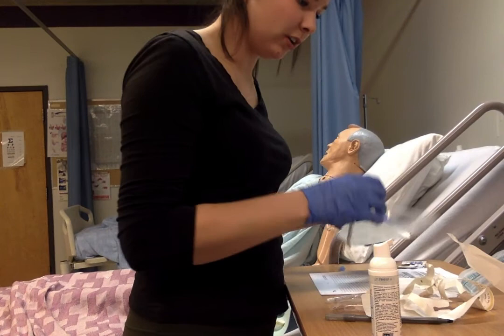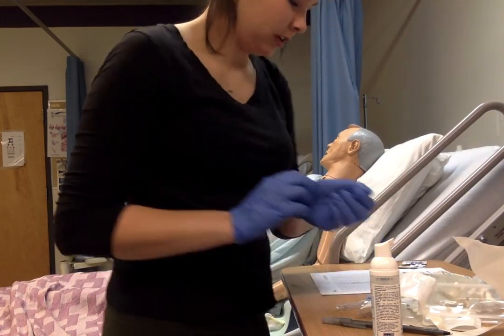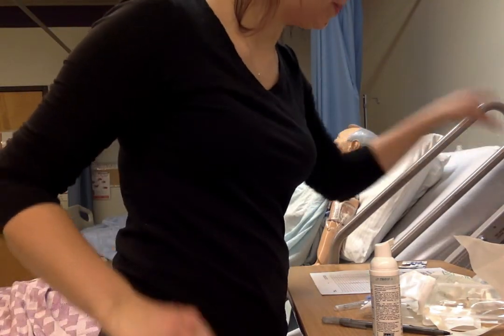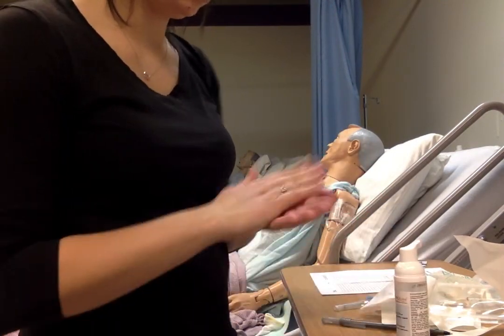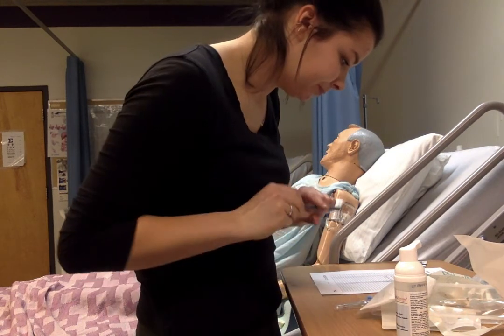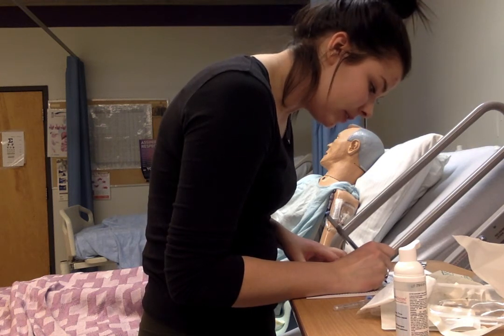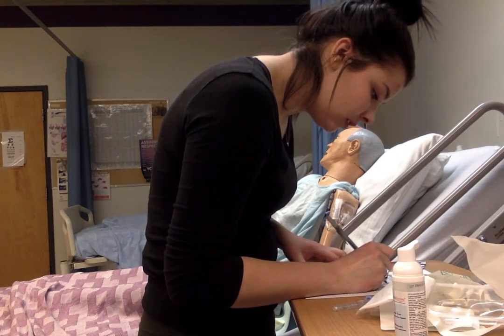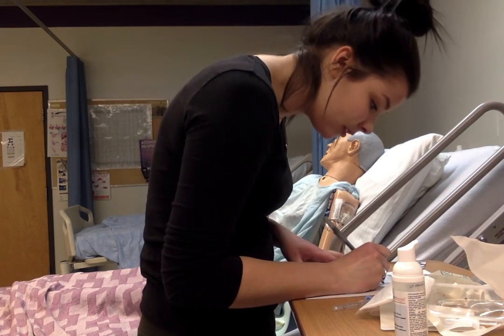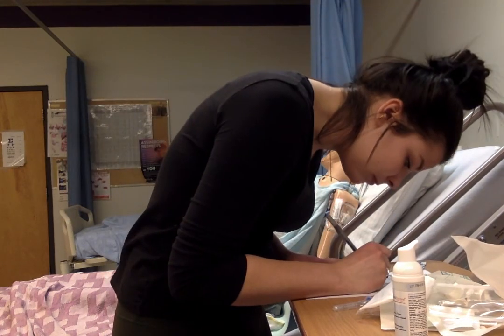Okay, so that is all good. That is nice and secure. That needs to go into sharps. So we can remove our gloves and throw them out. Now we want to wash my hands before I touch my pen. And we are going to document on the MAR that we established this on the 8th of 2020. And we did it at 20:05. And the site is on the right arm.